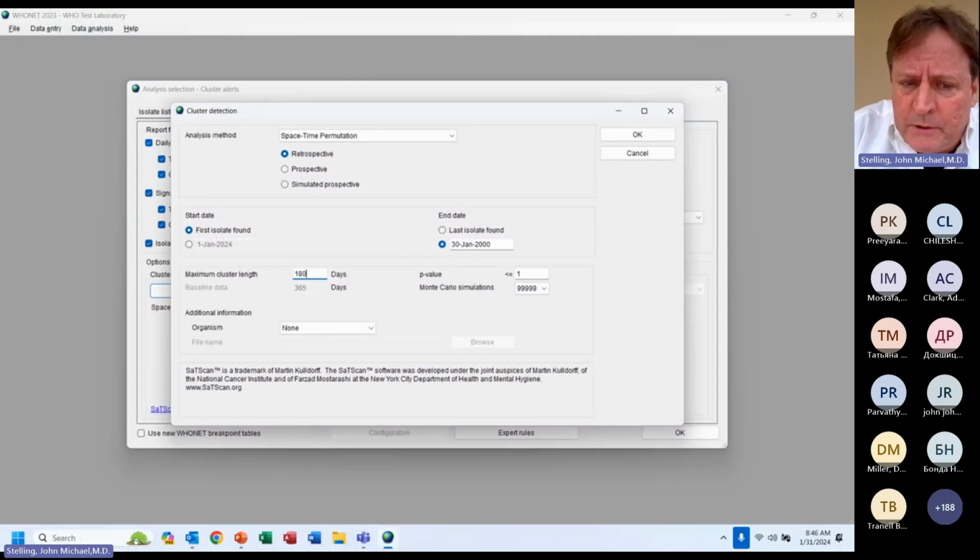We have had good results with this, but I don't want to say that what we have done is optimized. We encourage you to question some of these, play around with the parameters to see what you find works best in your situation.